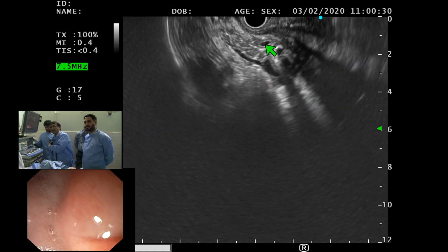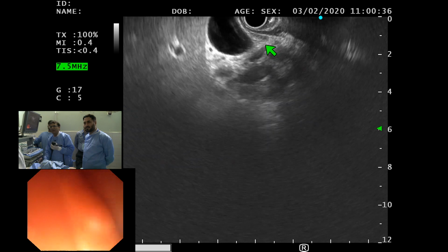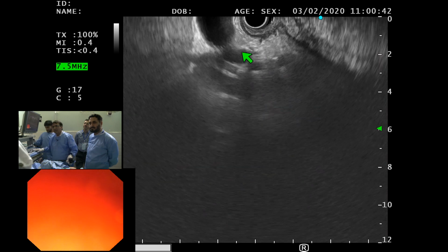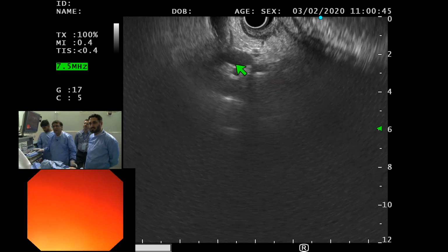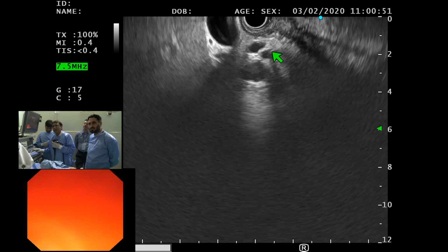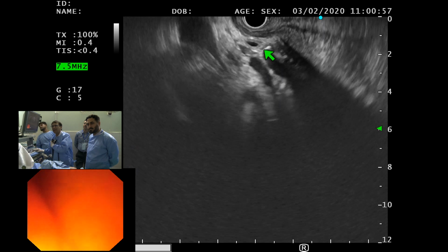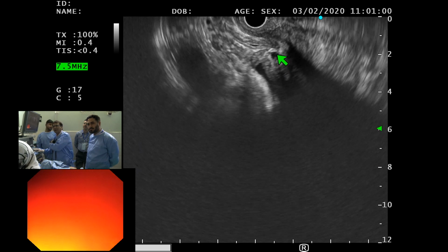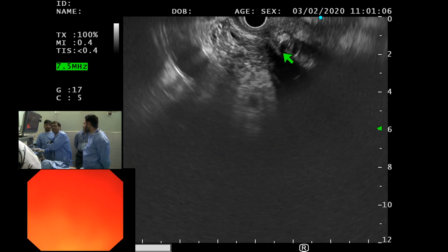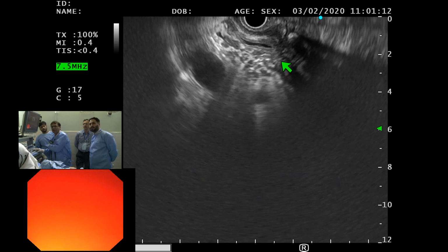So here you see all the way going down. That's a gallbladder there. That's a bile duct right there. Now it's less thick right there. It's more dilated, but the wall is less prominent there. But here it becomes quite prominent, where obviously there is all the inflammation in the head of the pancreas. At least I don't see a stone in there. But there's a lot of inflammation right there. It's all necrosis.